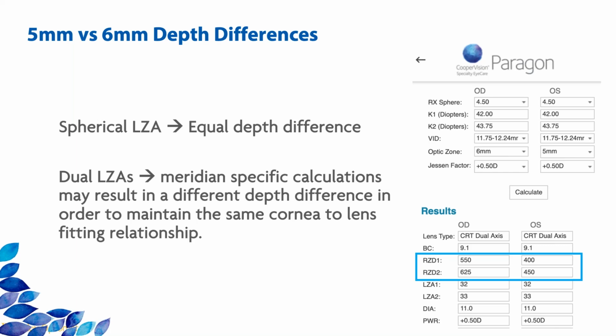Since we're a teaching clinic, anytime I'm seeing a significant angle kappa, I tend to ask my interns or residents to perform the topography both with central fixation and a nasal fixation so that I have the baseline information for both. I usually fit just based on whatever I have.